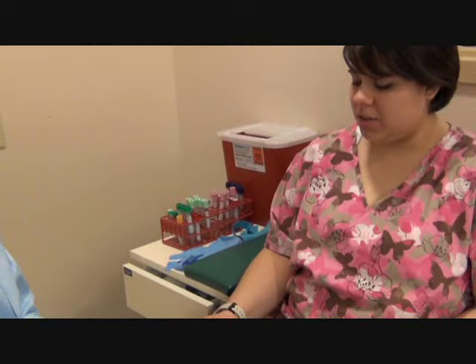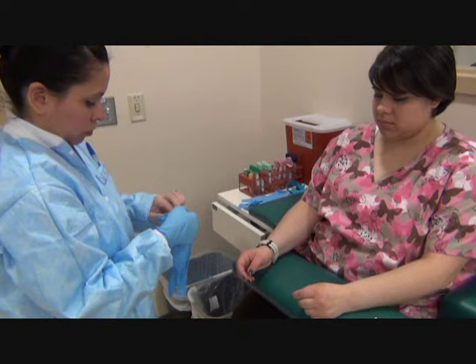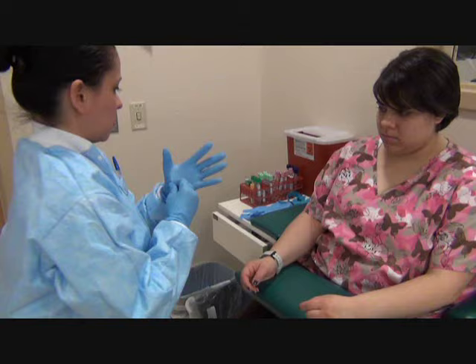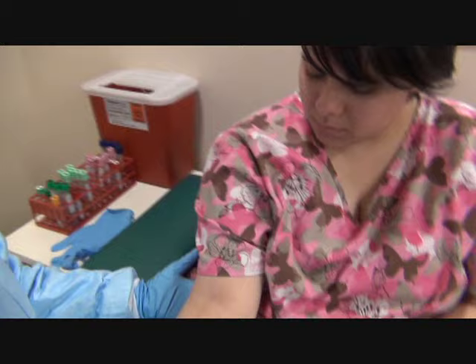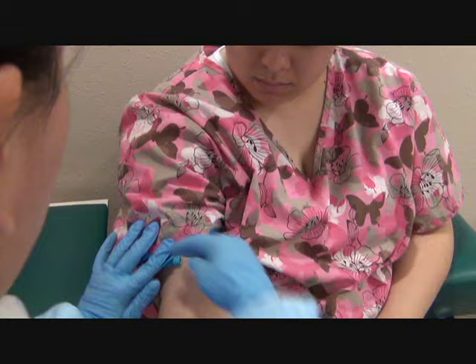Which arm do you prefer? Either one is fine. Let's take a look at this arm. You want to tie the tourniquet at least four inches above the site. Make a fist for me. She has a good vein — it's right in here, you just can't see it, so I'm going to pick a landmark.